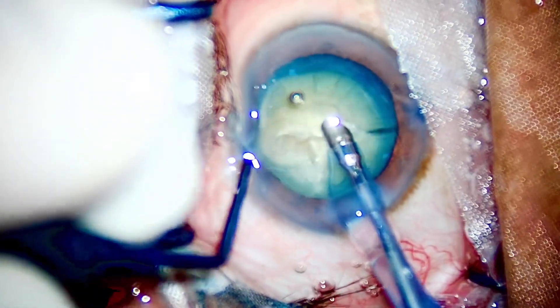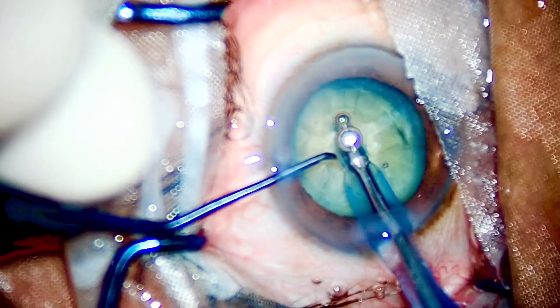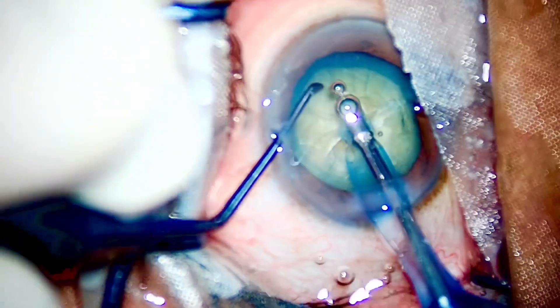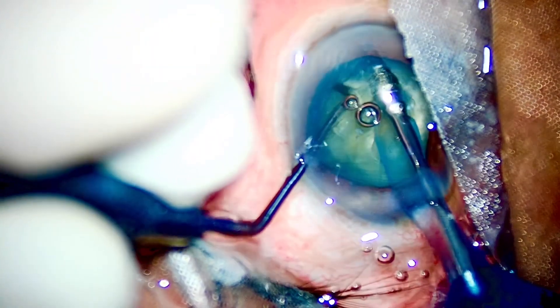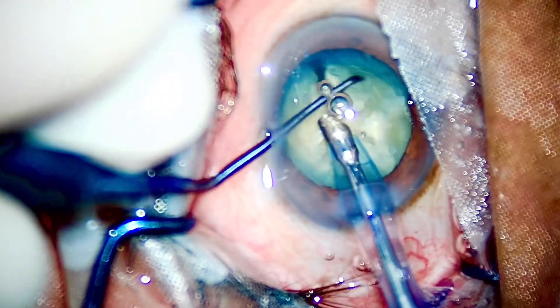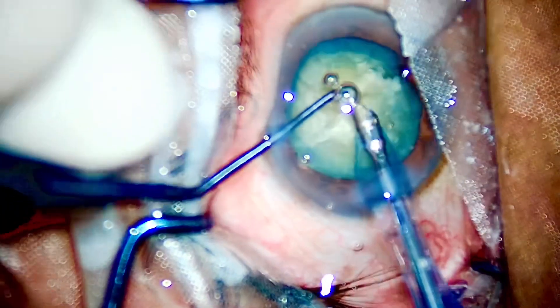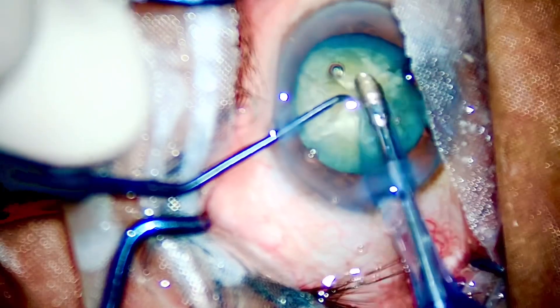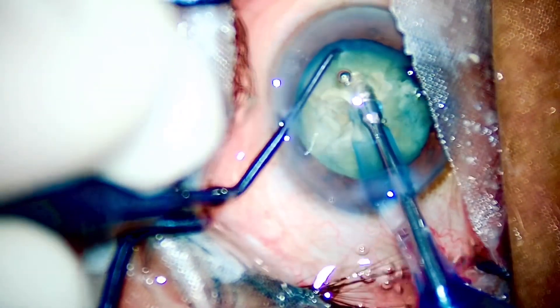Once again — the phaco pull and the chopper push should be in the vertical plane. They should be opposite in their vectors and not in some other directions. The vectors should cancel each other, and once they cancel each other you will automatically crack the nucleus apart.